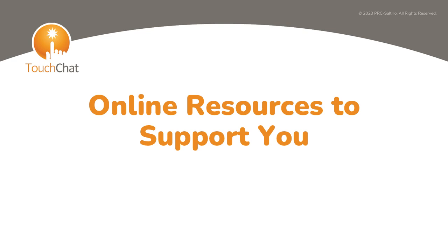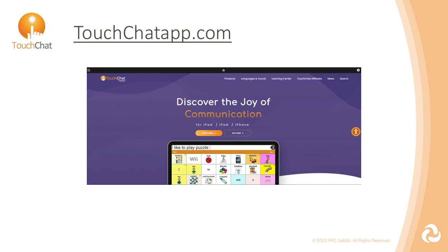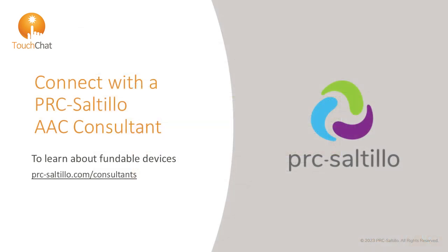Here are some great online resources to help support you. Visit the TouchChat app website to find more great resources to keep your system running smoothly, including the TouchChat app user guide and quick reference guide under the Learning Center tab. AAC Learning Journey offers live instructor-led courses as well as self-paced e-learning courses to learn more about TouchChat and how to implement AAC through your day. To learn about fundable AAC devices that include TouchChat, contact your regional PRC-Saltillo AAC consultant.